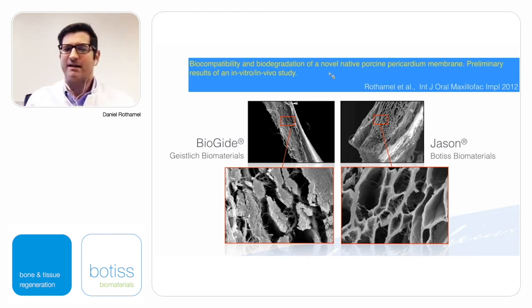It's more of a multi-layer network of still collagen type 1 and 3. But if it is made for the heart as a shell, where the heart is bumping 100,000 times a day against it, then of course the morphological structure is completely different.